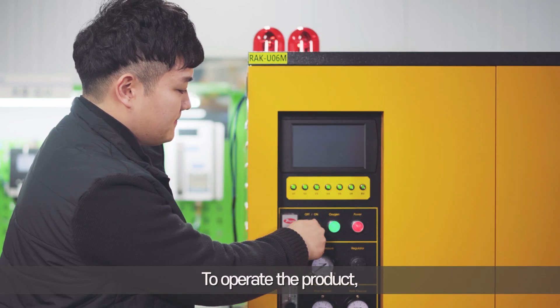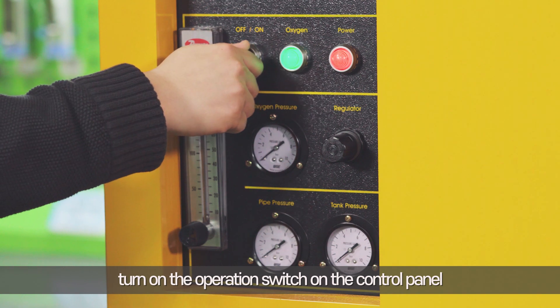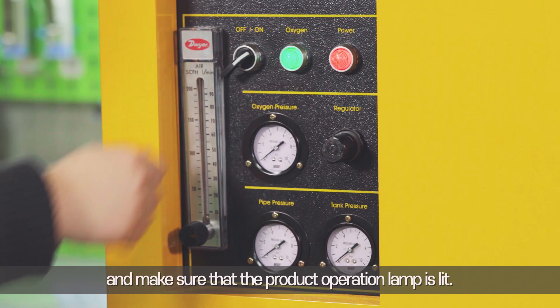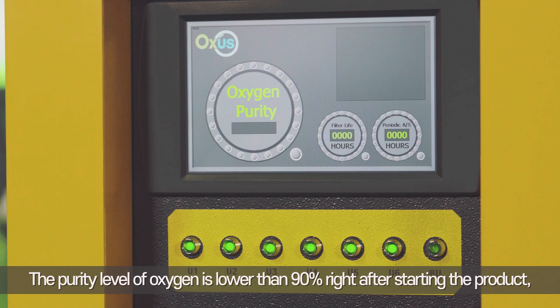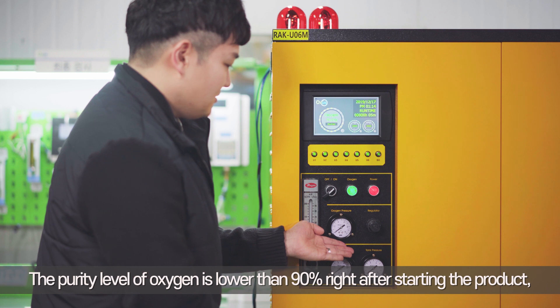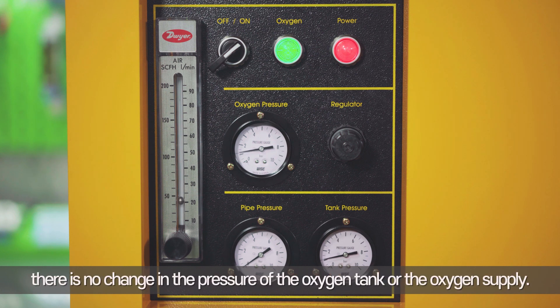To operate the product, turn on the operation switch on the control panel and make sure that the product operation lamp is lit. The purity level of oxygen is lower than 90% right after starting the product, so the system discharges concentrated oxygen for the first five minutes. At this time, there is no change in the pressure of the oxygen tank or the oxygen supply.